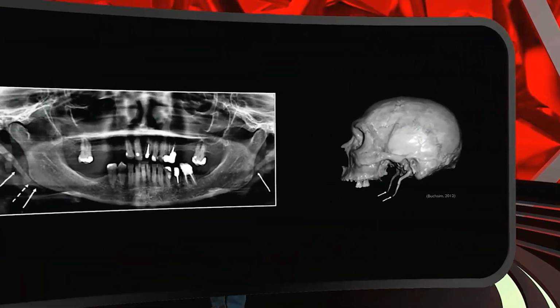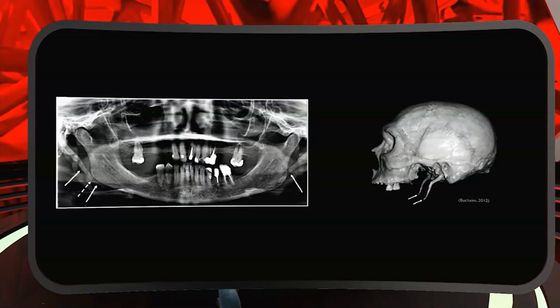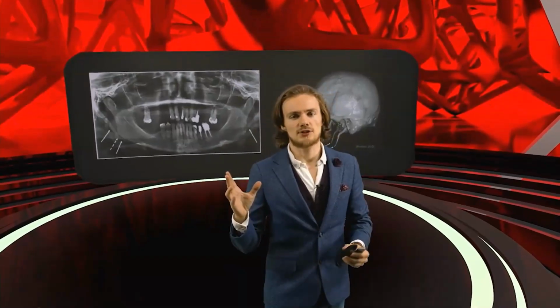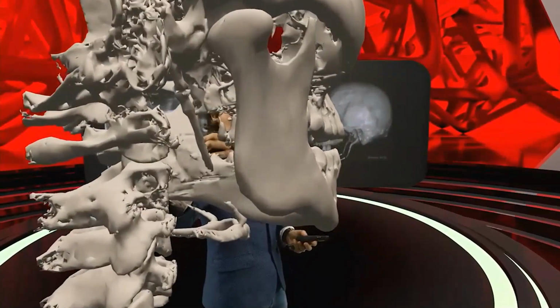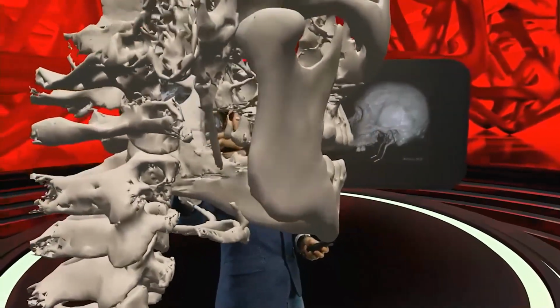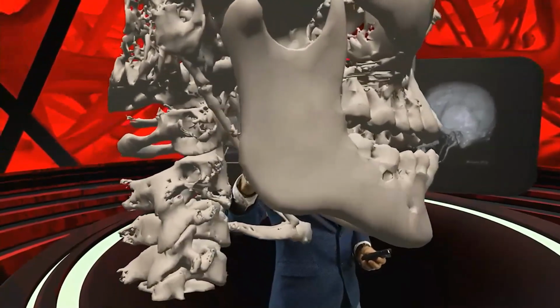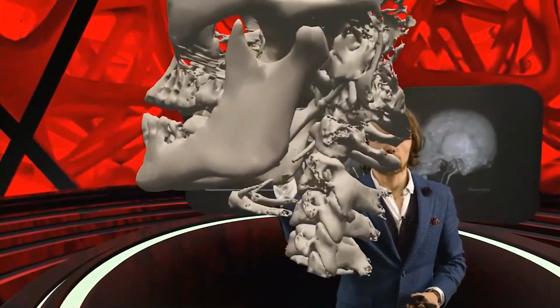What do we have now? So this is probably Eagle syndrome, when you see that long styloid process. But what does it mean that there is Eagle syndrome? Eagle syndrome you have when you have symptoms. But when your styloid process is longer than 4 centimeters, mostly 4 centimeters, then according to studies the patient becomes symptomatic. So in here we also see a very nice Eagle styloid process, very long and nice. In here as well, what you can see.